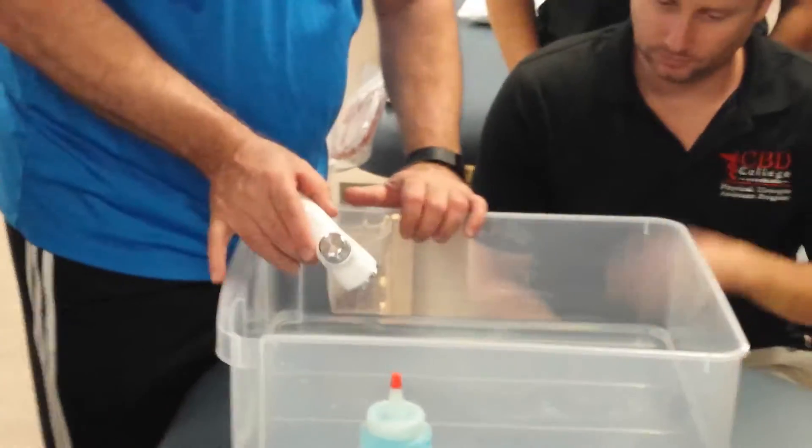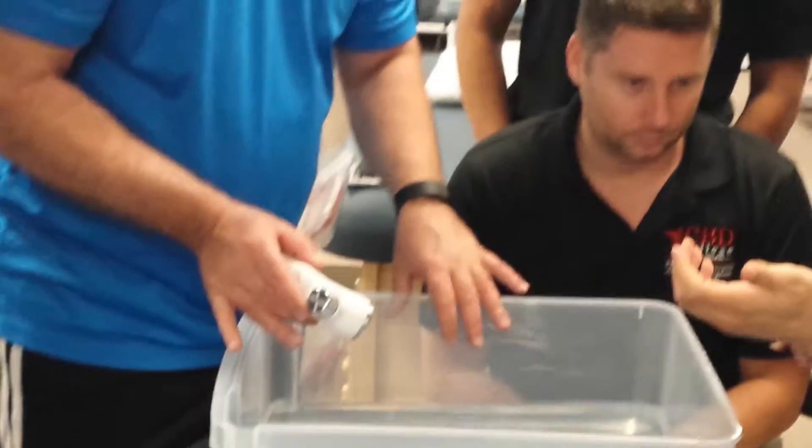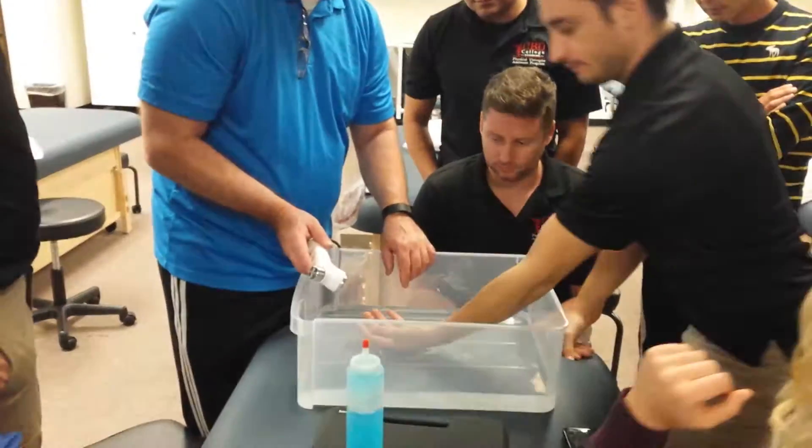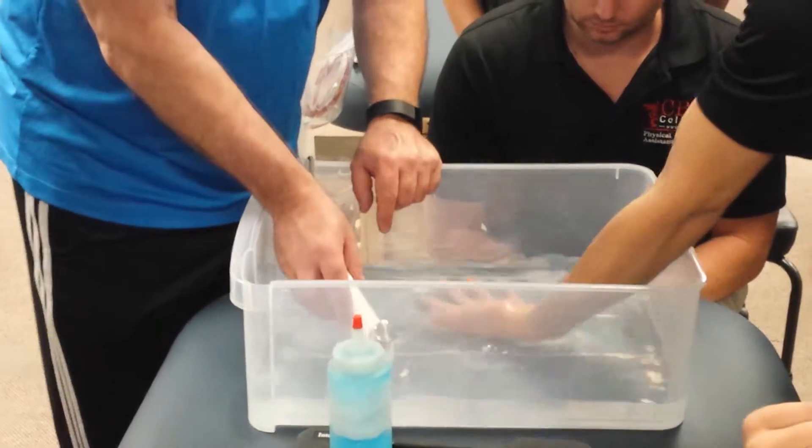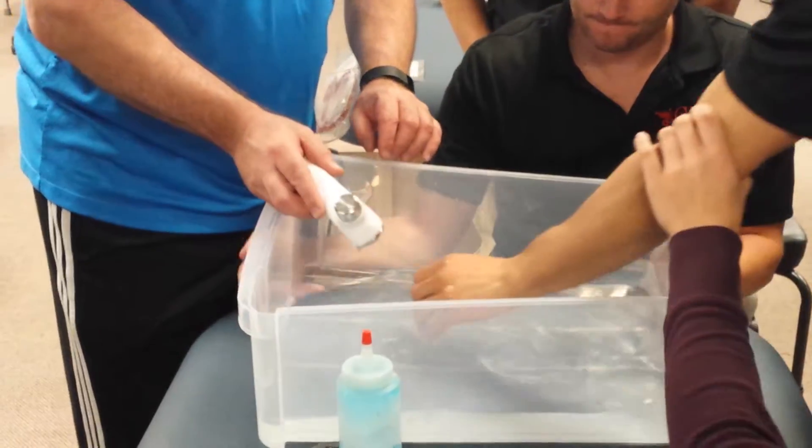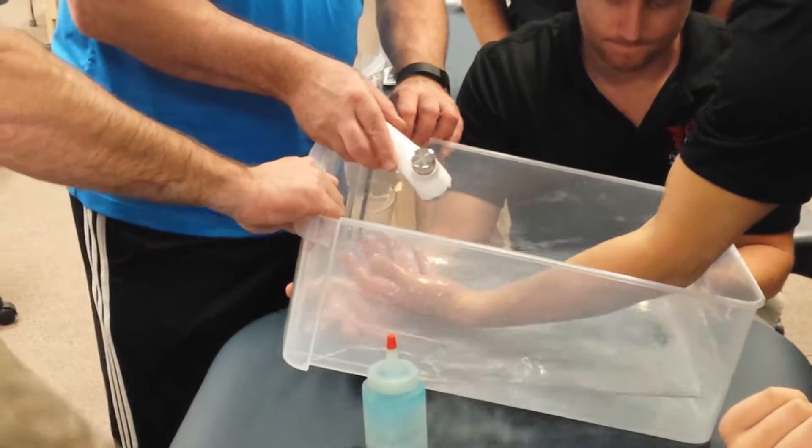So whichever hand or wrist. Okay, so go ahead and put it in the water. Is it on this side? I need more water. So what you want to do is go fill it up. There you go.